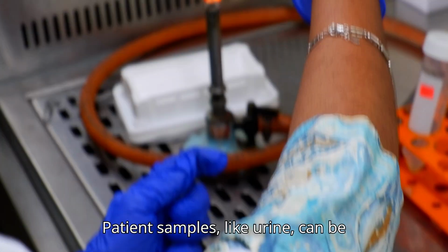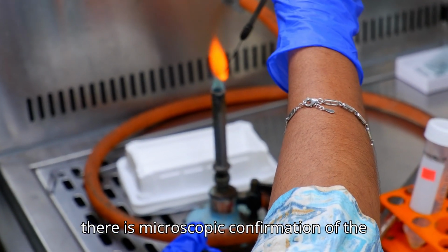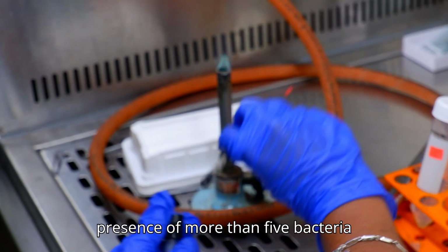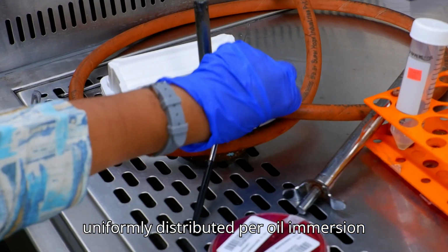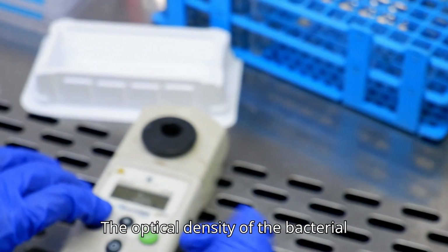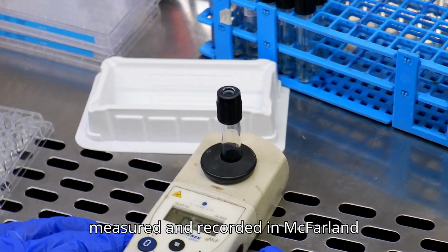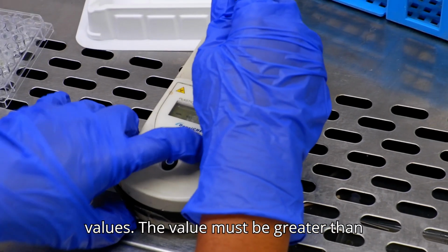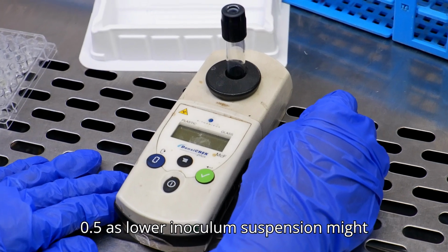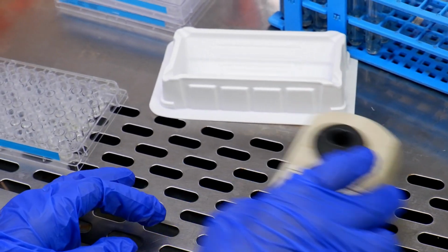Patient samples, like urine, can be directly used as the inoculum, provided there is microscopic confirmation of the presence of more than 5 bacteria, uniformly distributed per oil immersion field at 100x magnification. The optical density of the bacterial suspension in peptone water is then measured and recorded in McFarland values. The value must be greater than 0.5, as lower inoculum suspension might lead to longer incubation time.